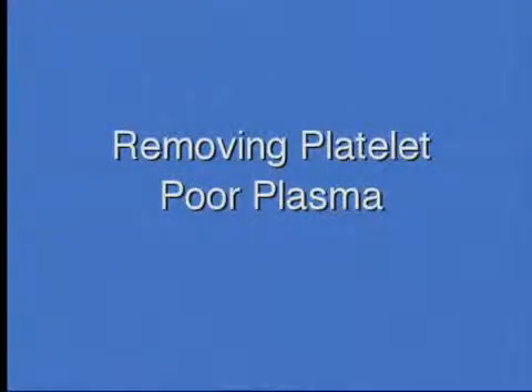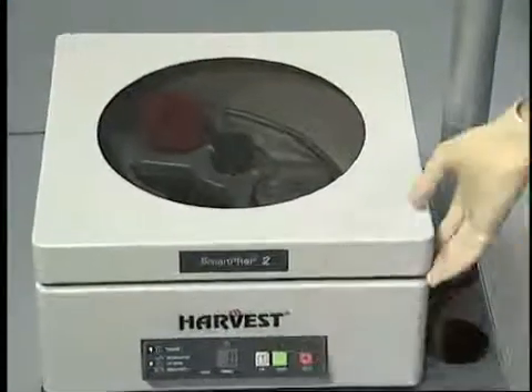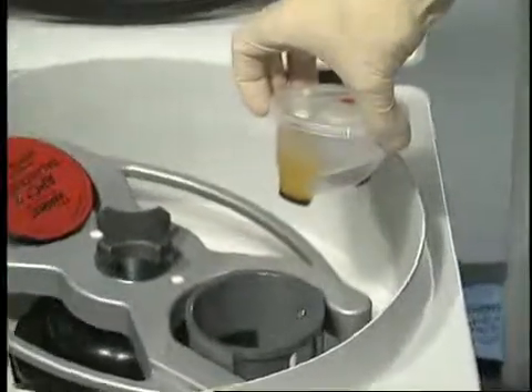Removing Platelet-Poor Plasma. As soon as the process cycle has completed, press the white lid button located on the front panel of the SmartPrep 2 system. Remove the process disposable.